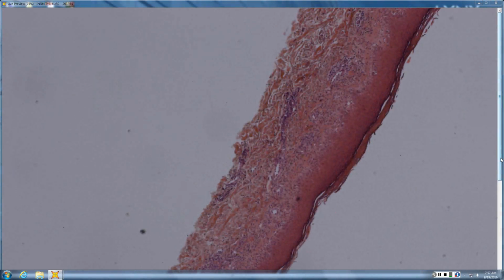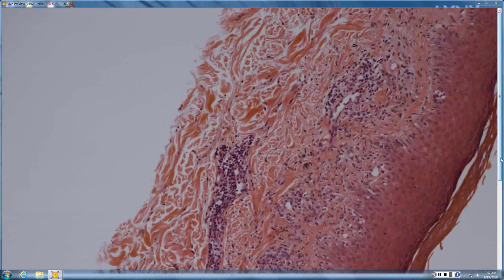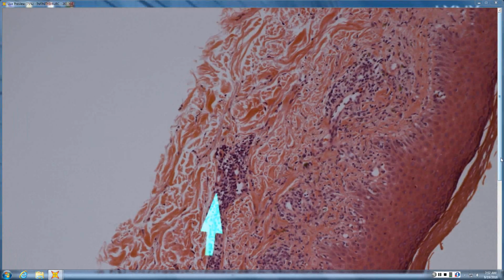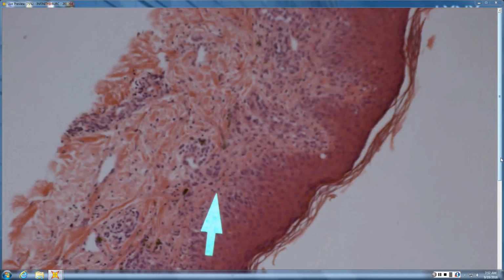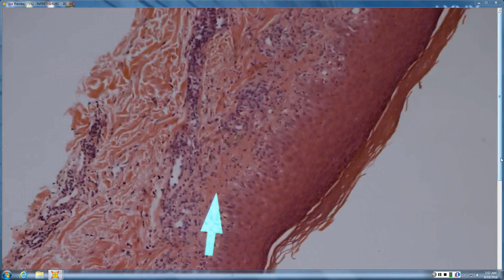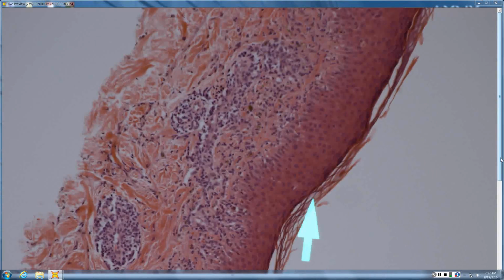Lichenoid infiltrate, perivascular, periadnexal infiltrate as well. Lichenoid interface, and you also have some perivascular, periadnexal, which always makes you think of the possibility of drug, lupus, lymphoma when you see that. More of a subacute horn. There's some pigment incontinence. Yeah, subacute. I mean, some areas it's been going on a little bit. You go out more towards the edge. Definitely more acute out here, right?